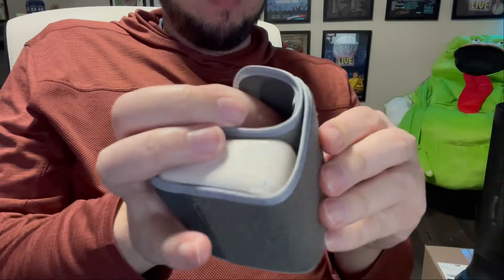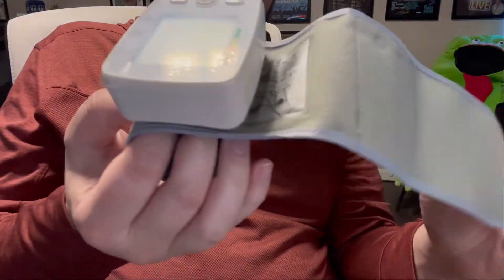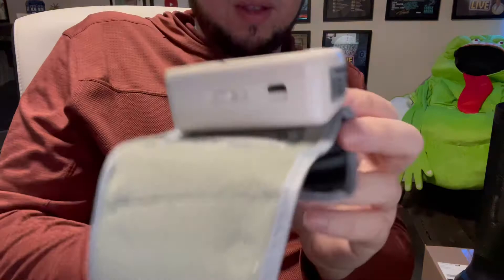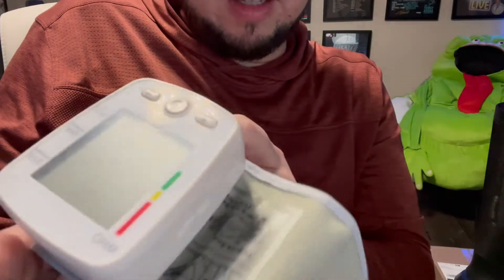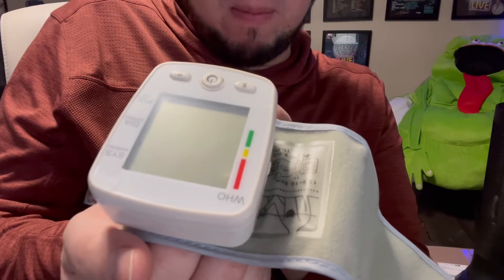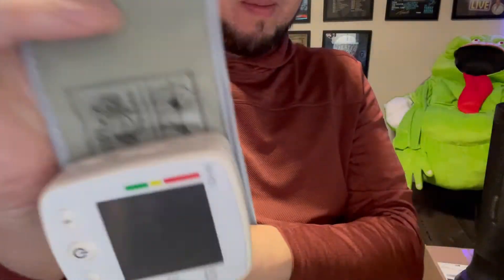Here is the cuff. Can you read this? It says 'wrist electronic sphygmomanometer.' So I don't know about this, but I'm just going to try it.